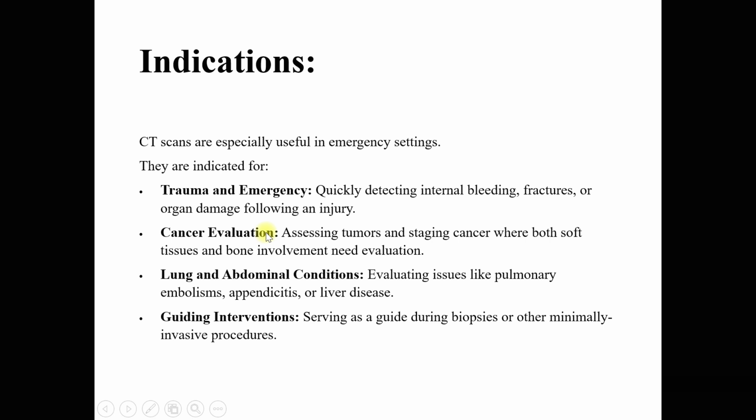The other indication is cancer evaluation, assessing tumors and staging cancer, where both soft tissue and bone involvement need evaluation. Lung and abdominal conditions, evaluating issues like pulmonary embolism, appendicitis, or liver disease. Guiding interventions, serving as a guide during biopsies or other minimally invasive procedures. As you know, most biopsies are guided by ultrasound or by CT scan. So in this condition, we use it as a guide for applying biopsies.